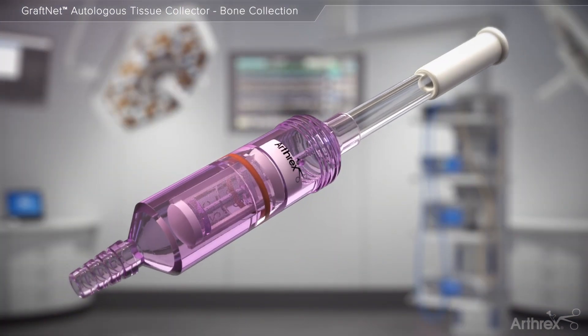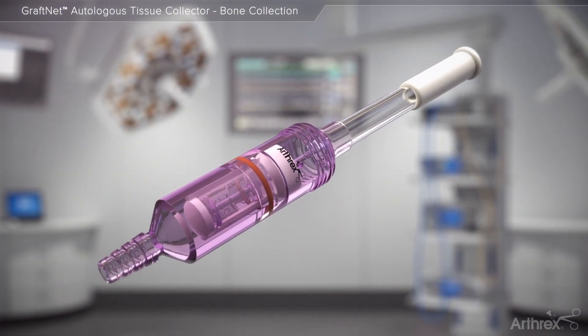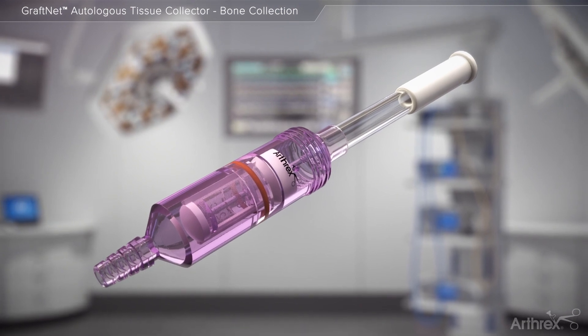GrafNet autologous tissue collector makes gaining access to autologous tissue as simple as resect and collect.